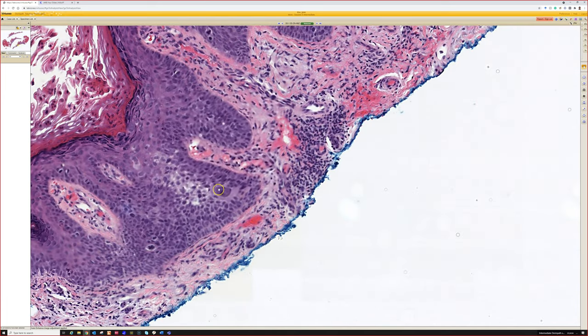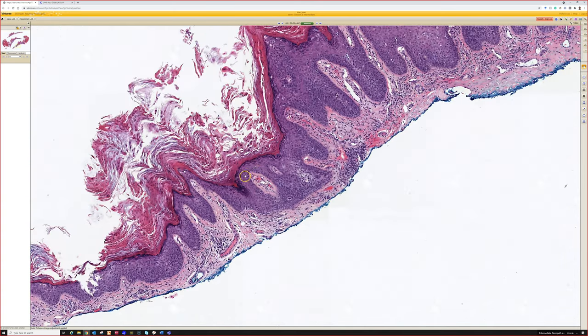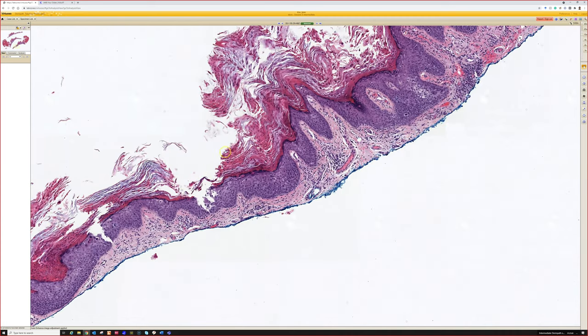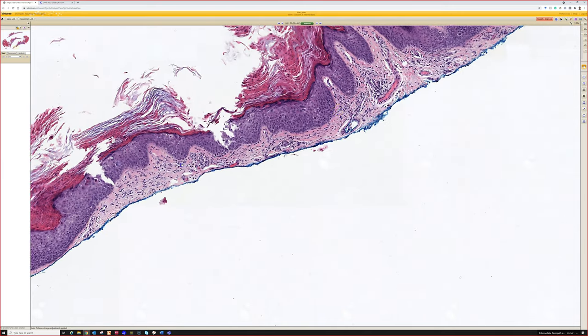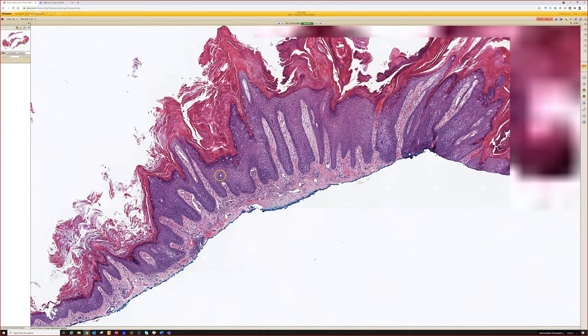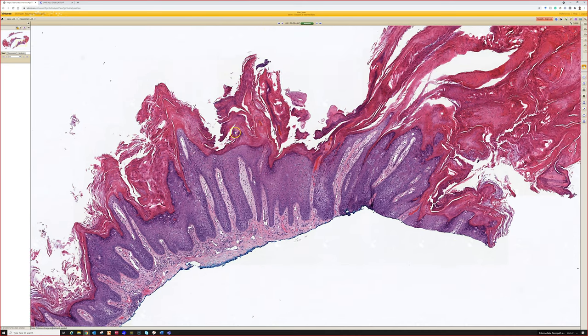Look, striking atypia here, a lot of mitotic activity in these. So usually it's not very hard. Oh, here, there are some full thickness areas, but they're pretty focal. This one just has dramatic, that's nice full thickness, but dramatic pagetoid spread. And of all the pagetoid things, pagetoid squamous cell carcinoma in situ is the most common one I see by far. I see way more pagetoid squames than melanoma and way, way more of both of those than Paget's disease.